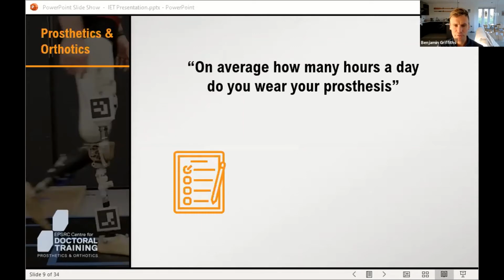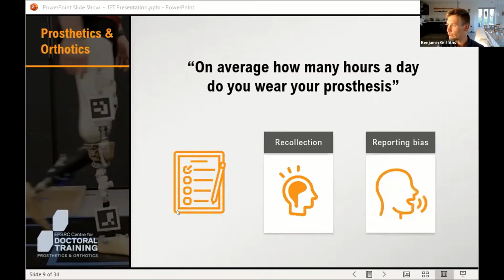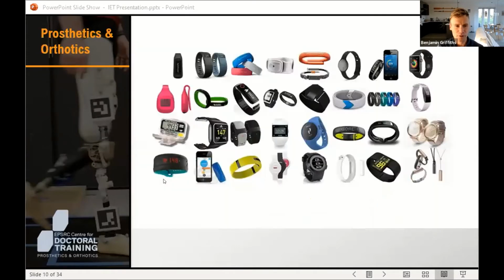Feedback in this way is often subjective and can be influenced by other variables outside the research team's control. If you ask someone to recall how often they use their device over the last few weeks, they might not be able to recall their usage correctly across the whole time period, just because it's difficult to remember that kind of information. Also, there could be some reason they might want to present more favorable information to the research team if they think they're going to get something out of it, or even the opposite. So although it's important that the user's opinions are taken on board, it's often necessary to complement this with objective methods for monitoring their device. So in order to do this, we turn to technology.